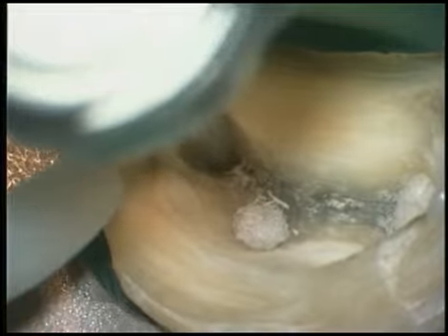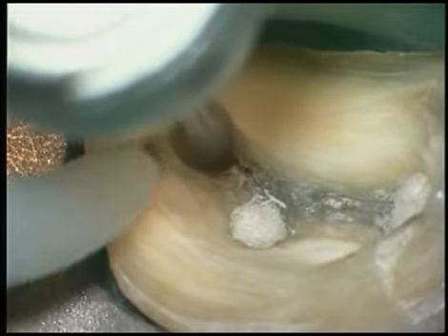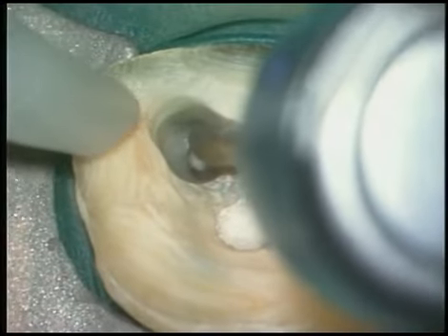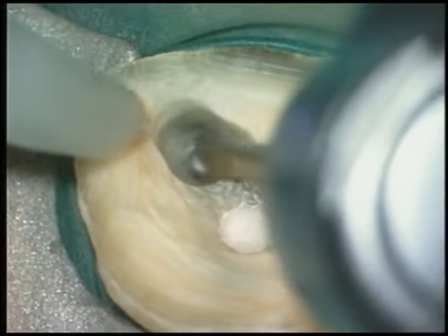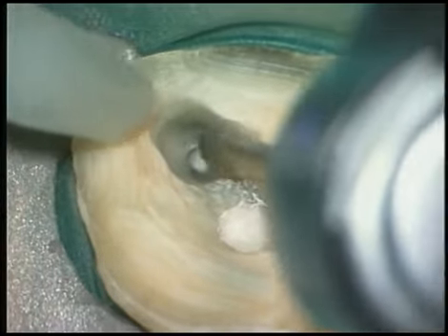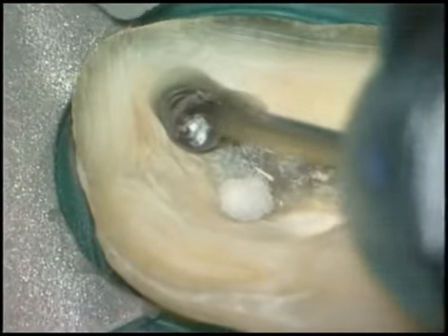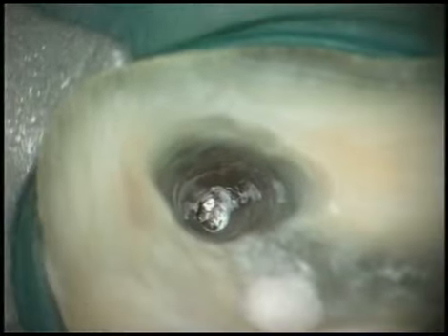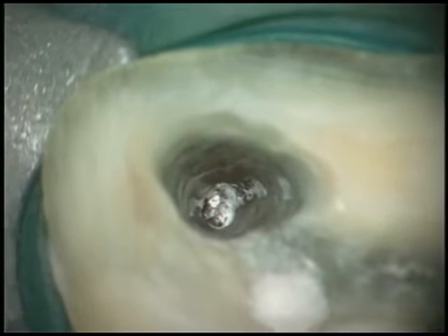Additionally, the belly of the bur can be used on the lateral aspect of the MB canal towards the MB2. This action begins to reveal the groove that typically roadmaps over to the MB2 orifice. GGs are used small to big, progressively stepping each larger GG out of the canal. This provides an excellent deep view of the broken obstruction.